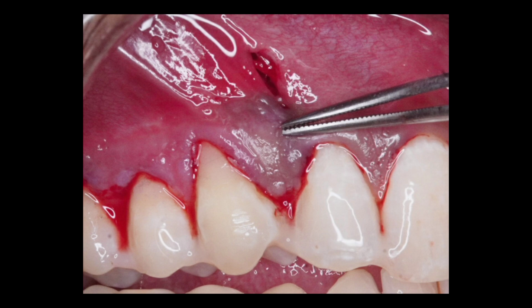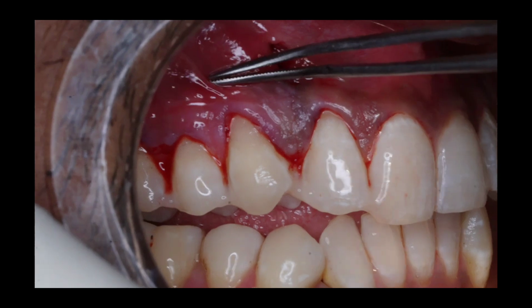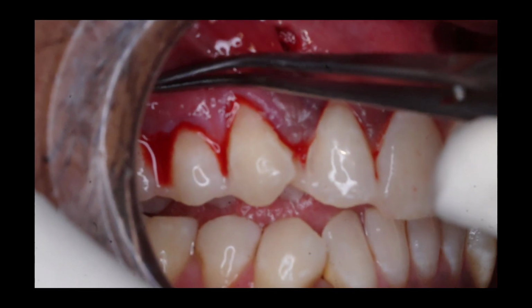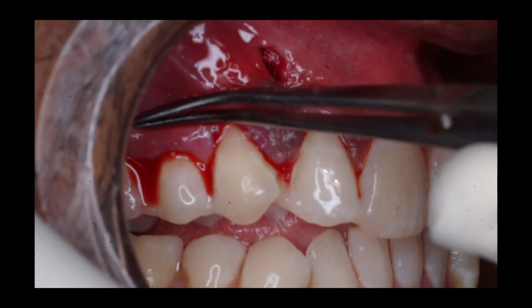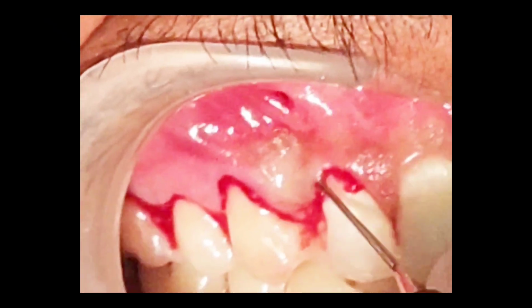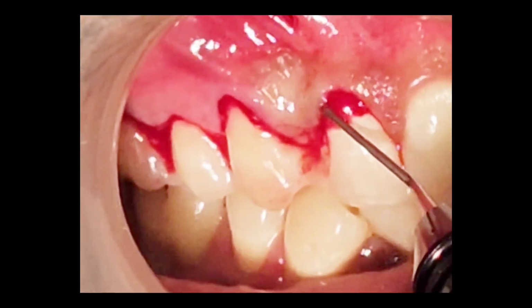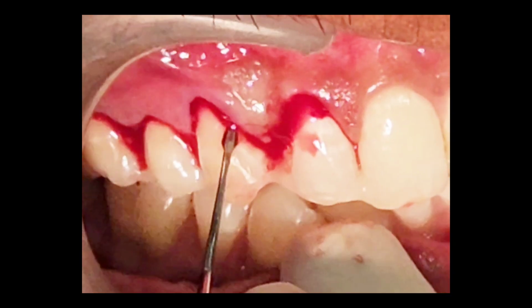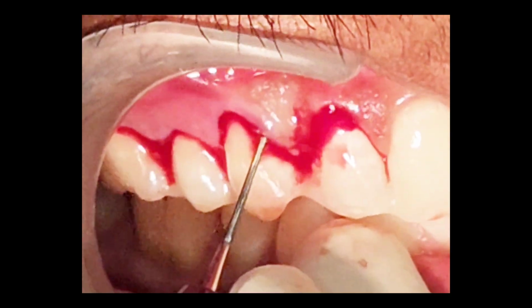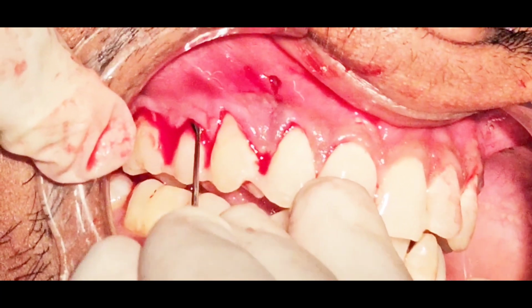So using a micro tissue forceps, we check the release of the flap. It's good for the lateral incisor as well as the second premolar. Some tissue still needs to be released at the first premolar level. So we use the tunneling knives now, especially around the papilla between the lateral incisor and the first premolar, to cause a full thickness raise.